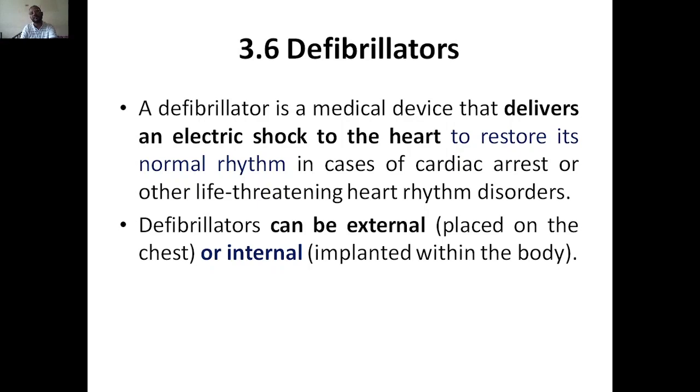So defibrillators are nothing but a medical device that delivers an electric shock, a sudden electric shock, to the heart so that it restores its normal rhythm in the case of cardiac arrest or other life-threatening heart rhythm disorders. If a person is experiencing cardiac arrest or a heart attack, or any kind of life-threatening heart rhythm disorder, then we can use these defibrillators.